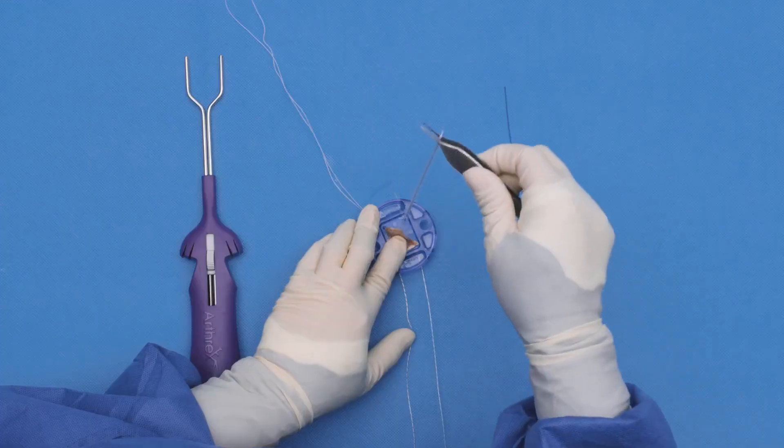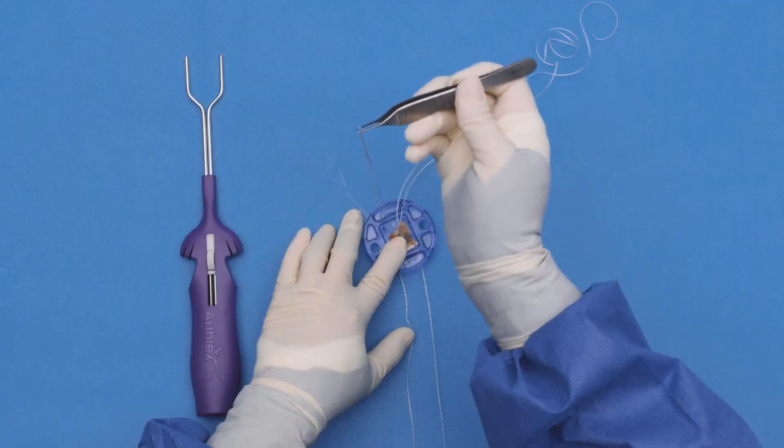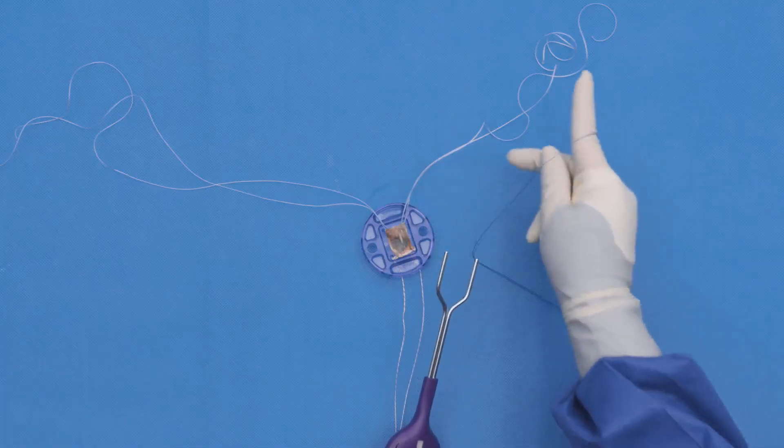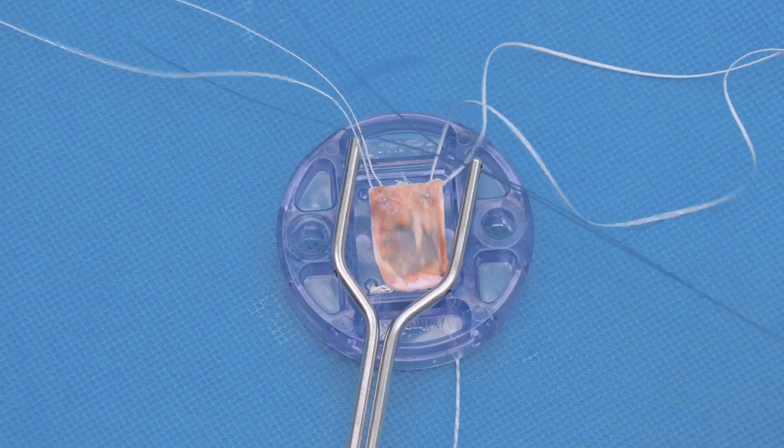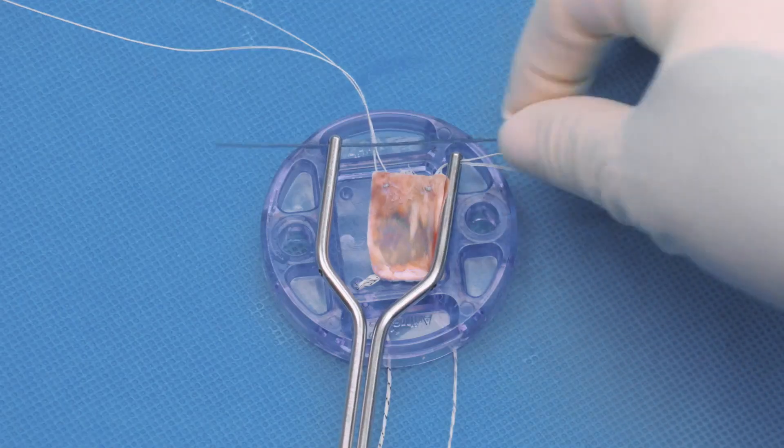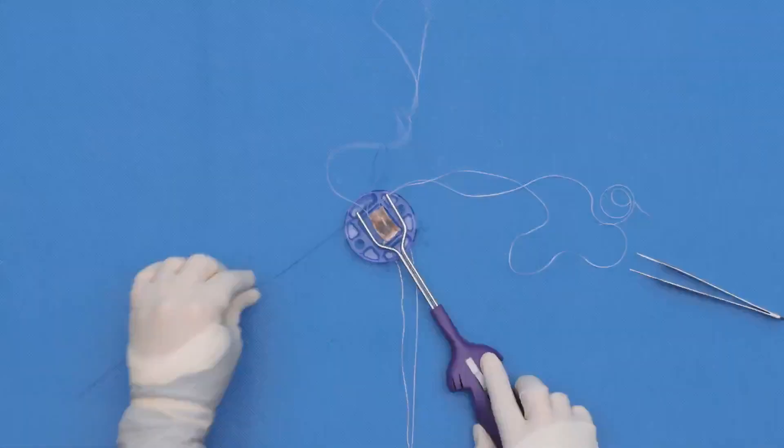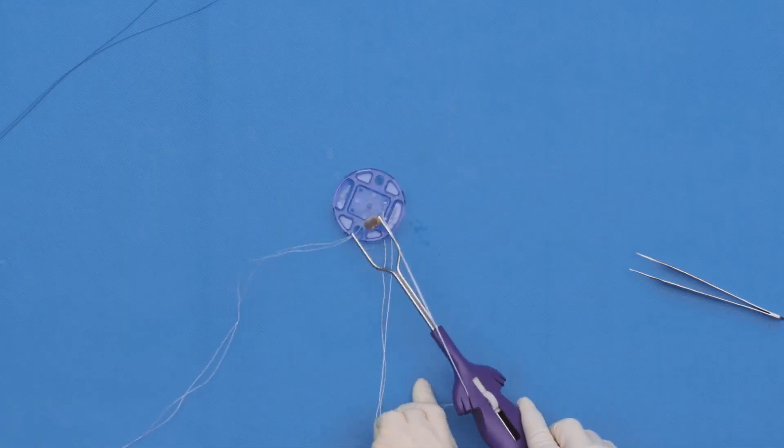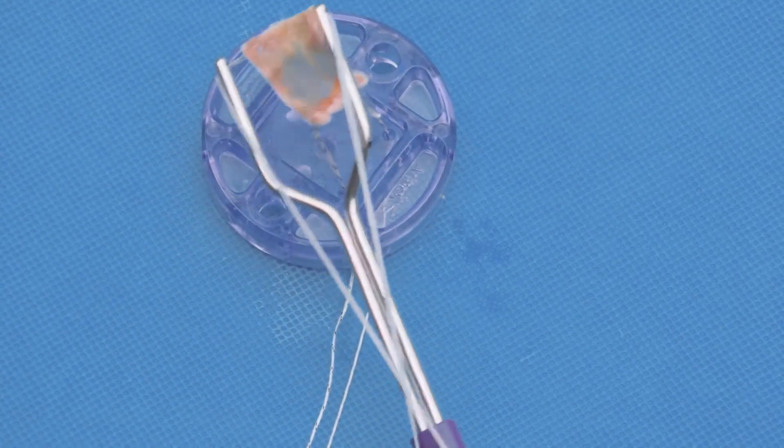Remove the medial stitches from the plates and pass the sutures through the distal ends of the graft spreader. Cleat the sutures into the handle of the graft spreader in a criss-cross configuration.